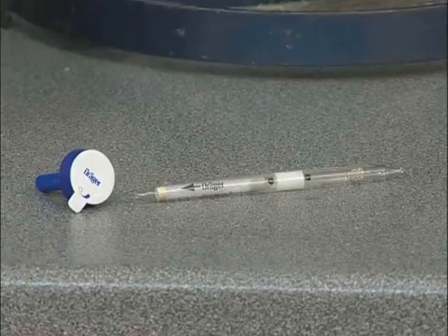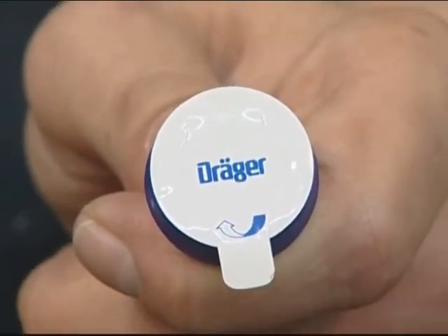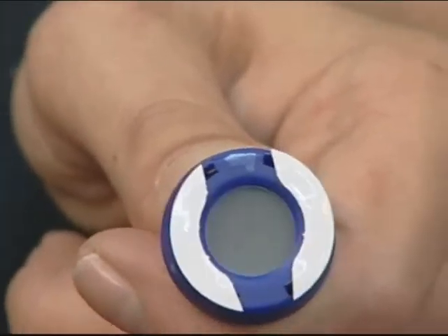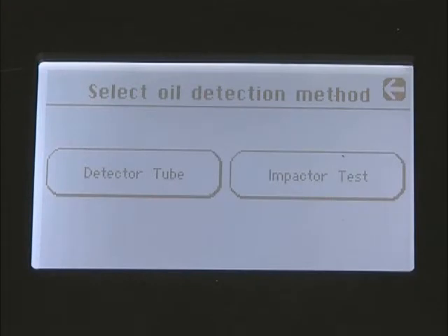The F4001 and F4001ED can test for the presence of oil using the original oil chemical reagent tube or the new impactor. The impactor has the advantage of not containing any hazardous chemicals. It detects all mineral and synthetic oils and clearly determines oil concentration levels. This training video is based on using the impactor.